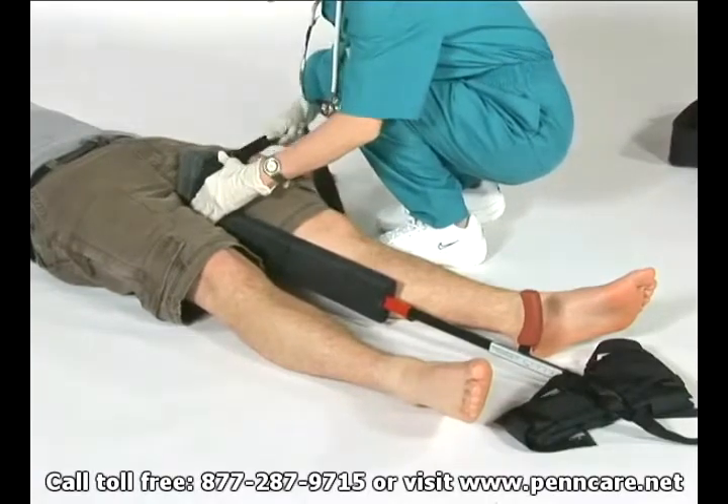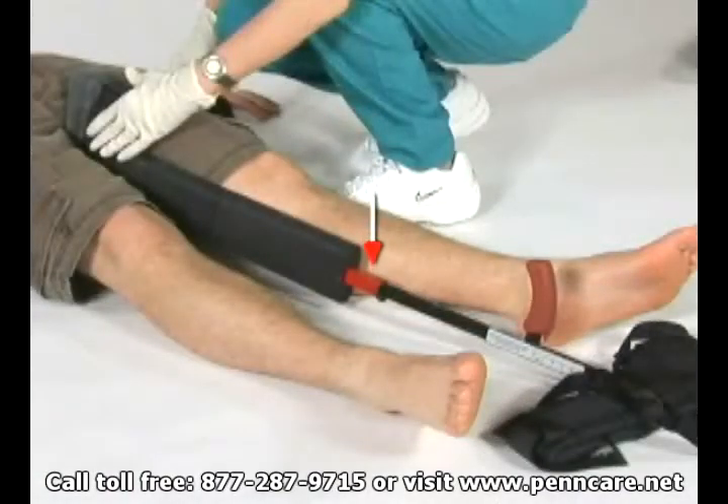Lift the spring clip to extend the inner shaft on the SX404 until the crossbar rests adjacent to the patient's heels. Note the absence or presence of distal pulses. Check for sensation.